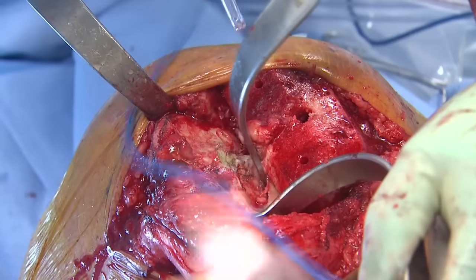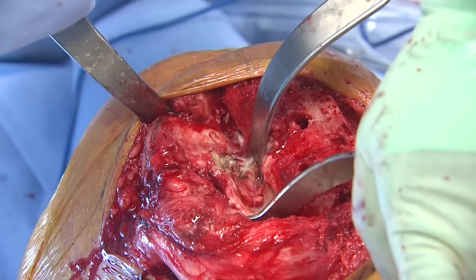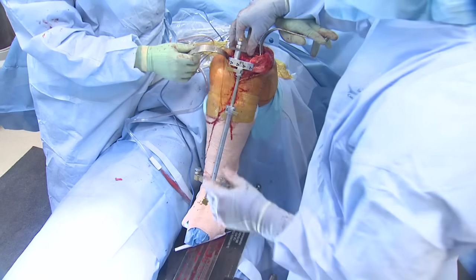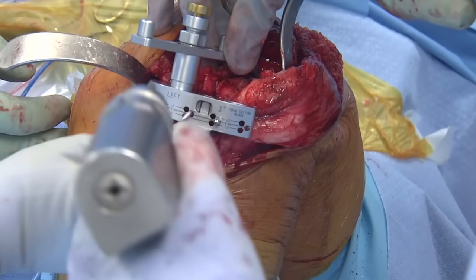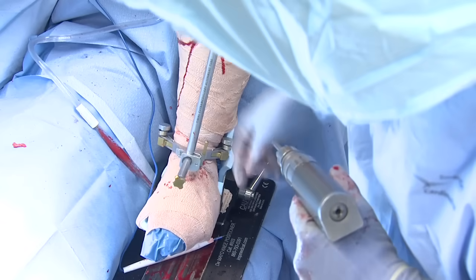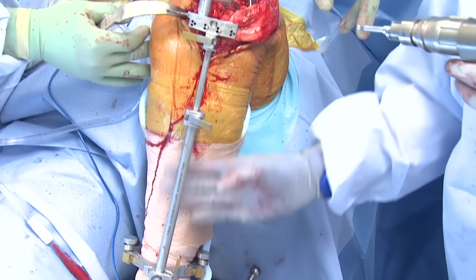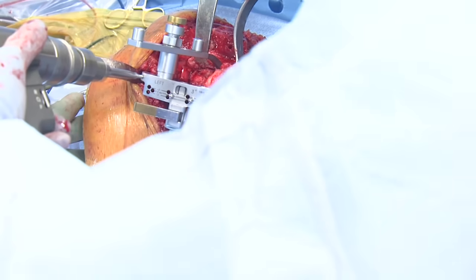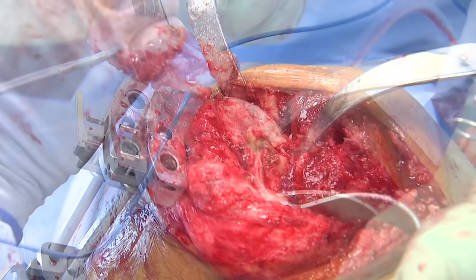Attention is then turned to the proximal tibia. The ACL is released and any capsular tissue is released to the posterior margin of the proximal tibia. The extramedullary cutting device is applied to the tibia and pinned in a neutral position on the proximal side. Position is confirmed within the coronal plane following the axis of the tibia and in the sagittal plane. A third pin is used to hold position, a tibial cut is made and the bone is resected.